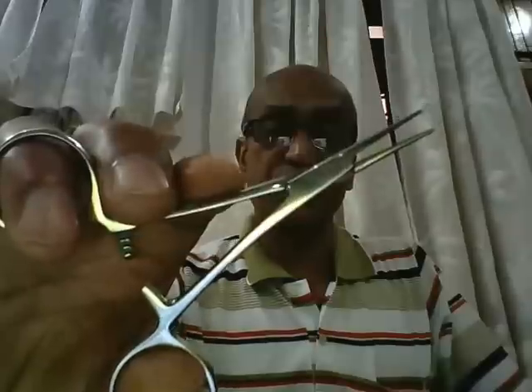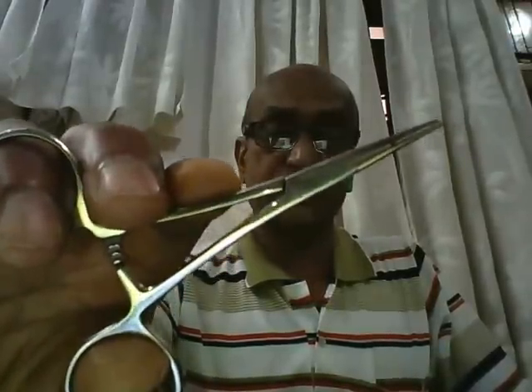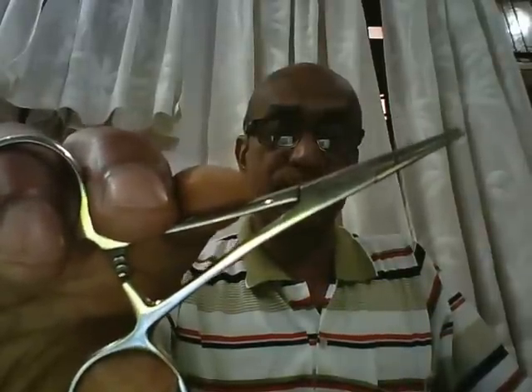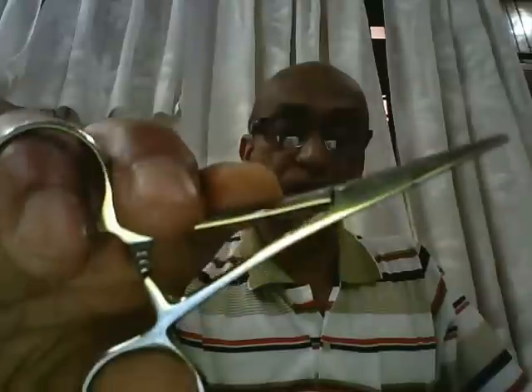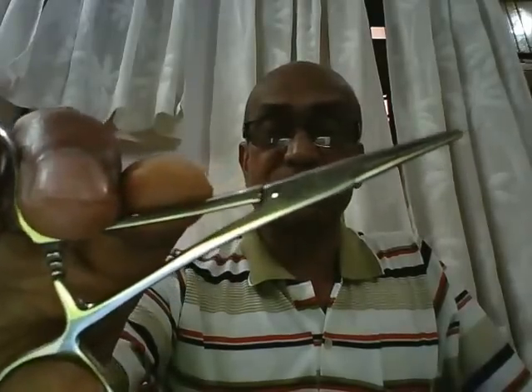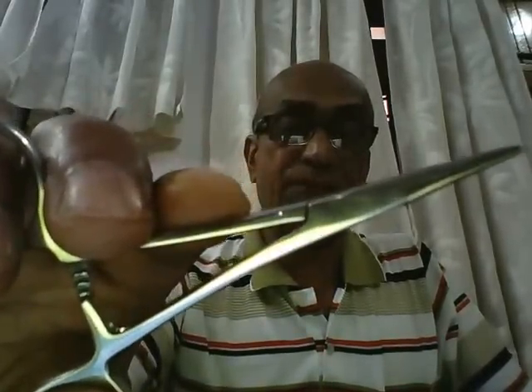The first instrument you see here is known as a pair of artery forceps. There are plenty of types of artery forceps, depending on their sizes and whether the tip is straight or curved. This is a straight artery forceps, and because it is four inches or less in length, it is also referred to as a mosquito or a Halstead forceps.